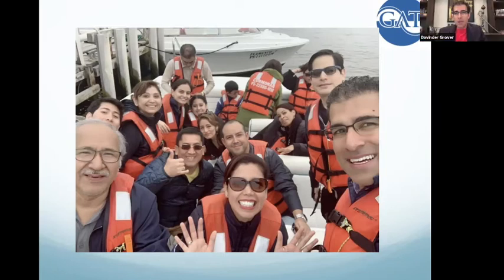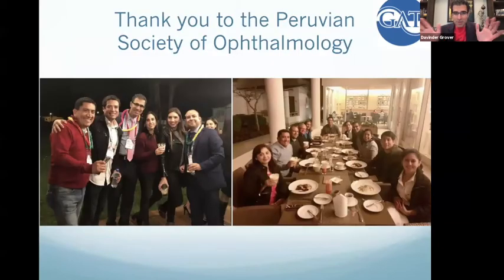Yeah, there's a big push now, most of it out of Canada, to do what they call a hemi-GATT, where they treat 180. They're soon to be publishing their data, and it looks pretty good. I think if you treat 180, you should probably treat the nasal quadrant, because that's where the highest collector channels are. I think it can work, especially in patients that have a higher risk of bleeding or you don't need as much pressure lowering.